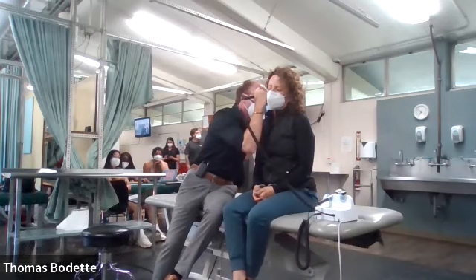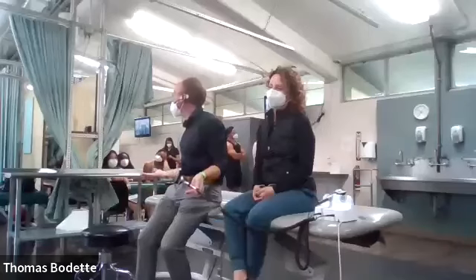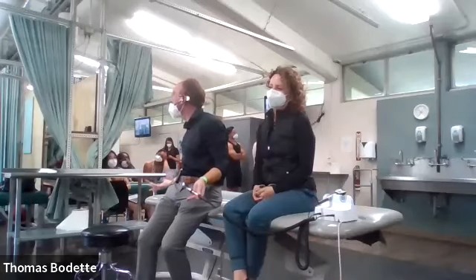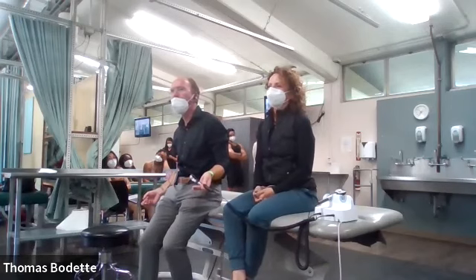Needless to say, this instrument needs to be on. Oh yeah, there's the cone of light, and you didn't turn it on. Come on. How can there be a cone of light if there's no light? I've seen some stuff over the years.